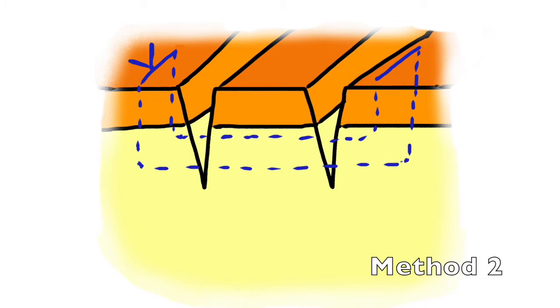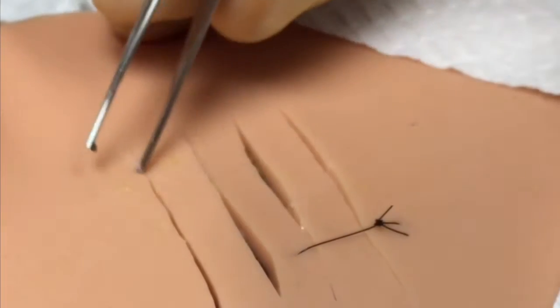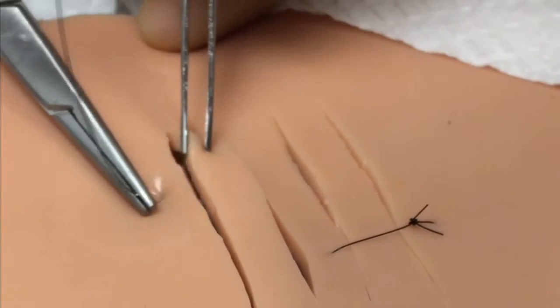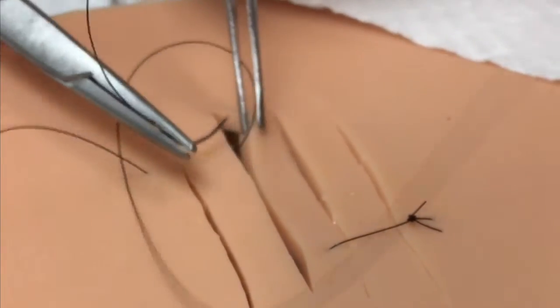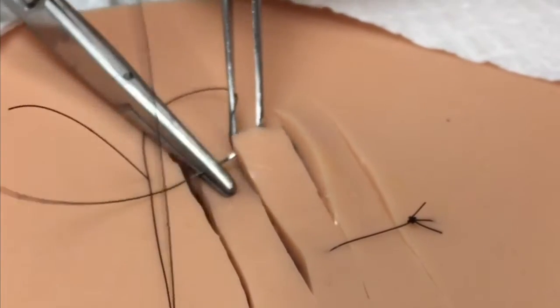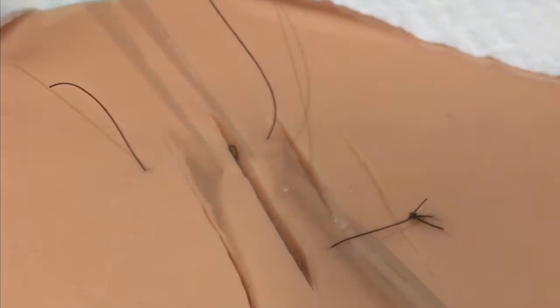Method two involves placement of a horizontal mattress suture type pattern in order to bring together the parallel lacerations. You'll drive through the epidermis into the dermal layer, through the tissue island, and then again on the far side through the dermal layer and out the epidermis. Then, as with any horizontal mattress suture, you will backhand the suture.